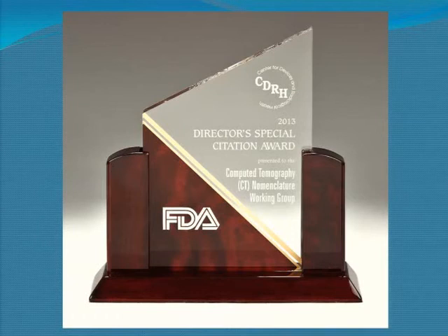So we had already been wildly, compulsively putting the display field of view on all of the documentation for our imaging requests. And we thought, gee, display field of view is a fairly reasonable surrogate for patient circumference. It's not perfect, but it's kind of ballpark. And so we have been using the display field of view to separate our smaller and larger patients.